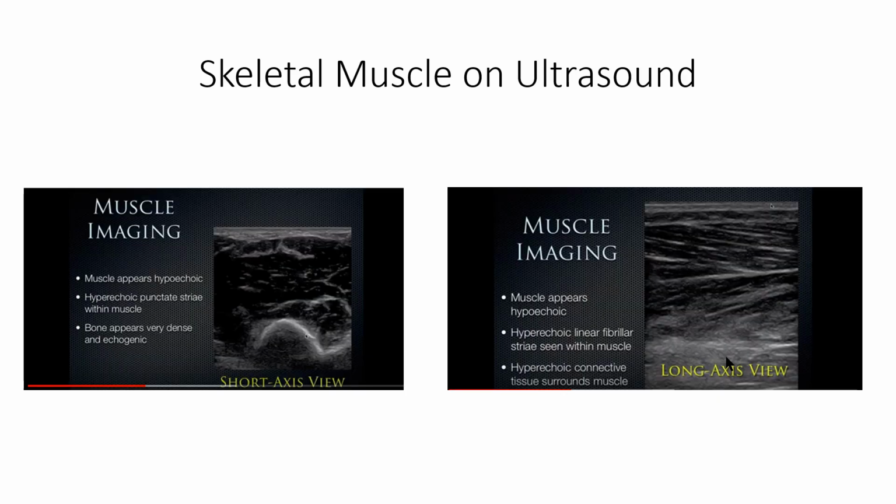On skeletal muscle ultrasound, in the short axis again, we're going to see this hypoechoic appearance, and this is a short axis through the muscle fibers themselves. Interspersed here, we're going to see fascia, and that fascia is the dense connective tissue which is encasing and wrapping around muscles and providing separation. Then if we get down to the cortex of the bone itself, this would be a short axis cut through the bone.